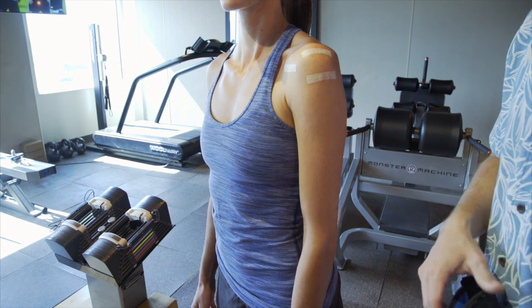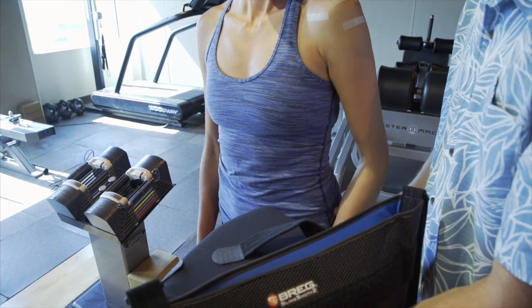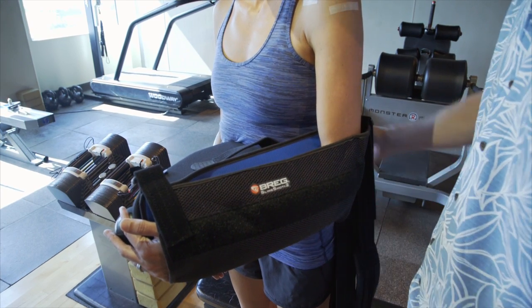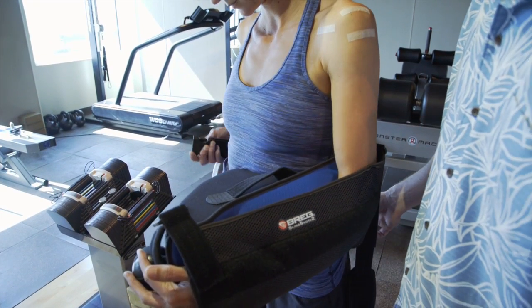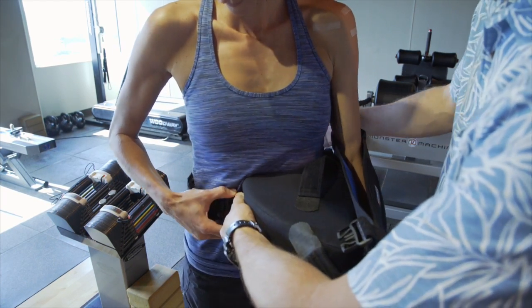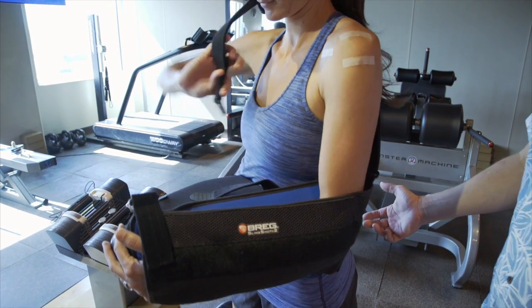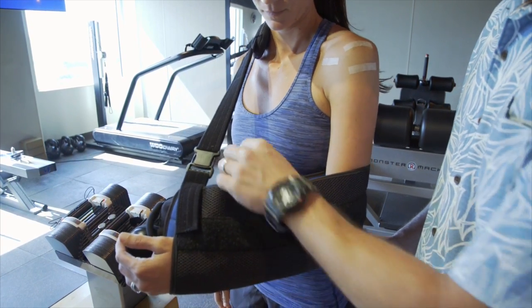After you take your dressings off, the easiest way to put your brace back on is to either have somebody hold it for you or rest it on a table. Bend your elbow up and slide your hand all the way in, then hug the brace to your body and it'll stay. Reach behind your back, grab the waist strap, come across and buckle it in. You may need some help at first. Then reach behind your back, grab the shoulder strap, flip it over yourself, and hook it into the buckle.